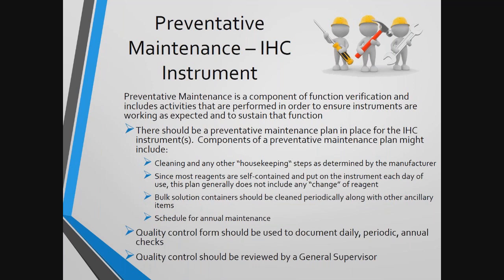Many of the tasks associated with preventative maintenance are general housekeeping items, such as cleaning up spills and washing out or cleaning containers or other ancillary components of the instrument. However, there are also more involved tasks that must be completed on a regular basis, such as maintenance like you would do on a car.